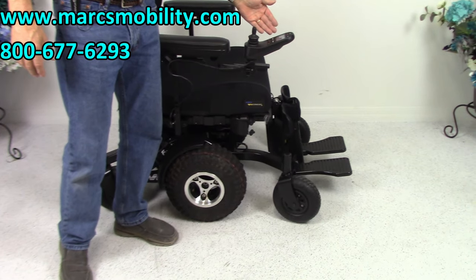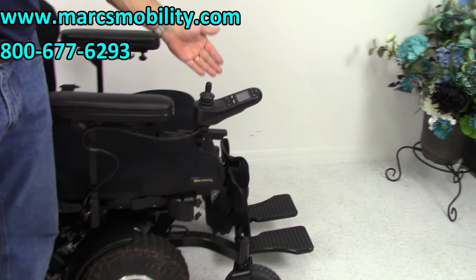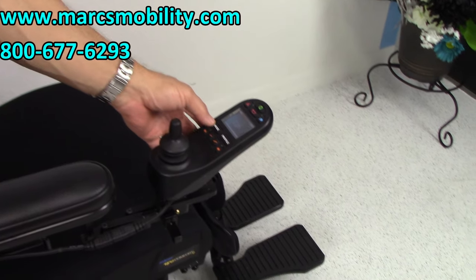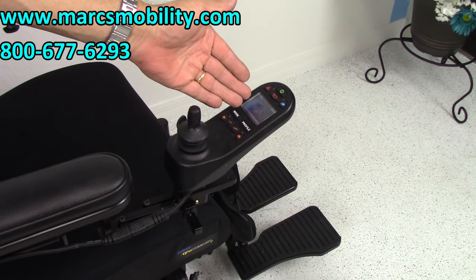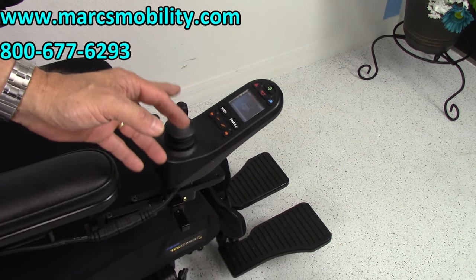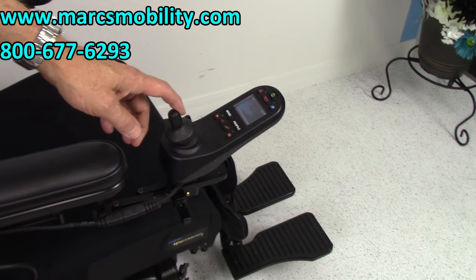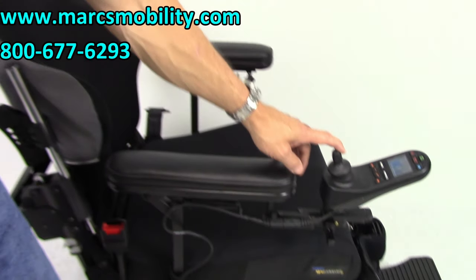To operate the functions, you go to the joystick right here, hit the mode button, and then you have your seat pictures on the display. Move the joystick until you see the function you want, then move your joystick back and your seat will start going up.